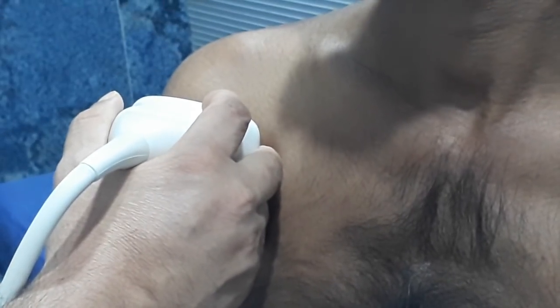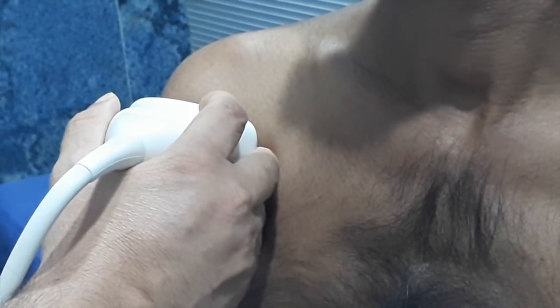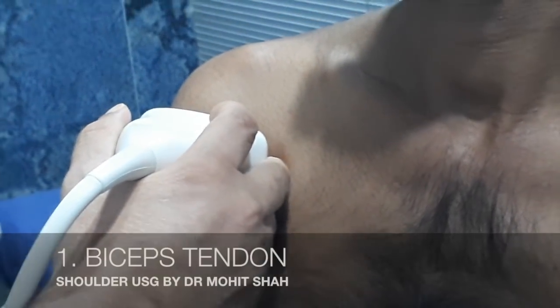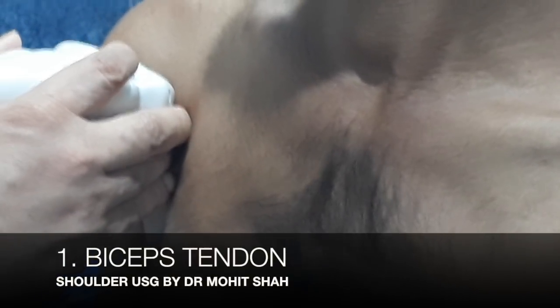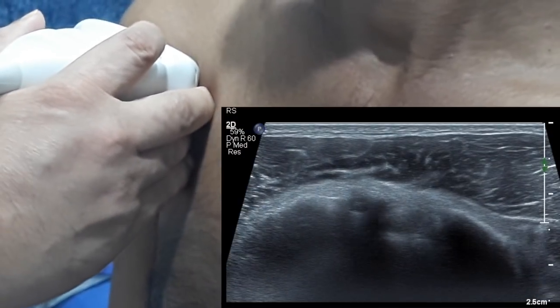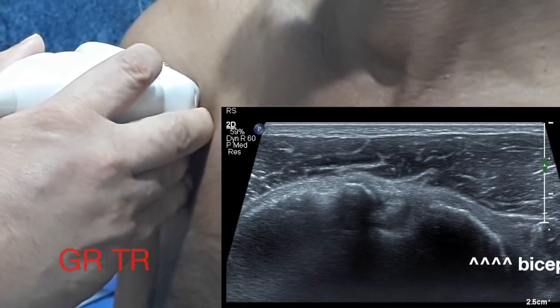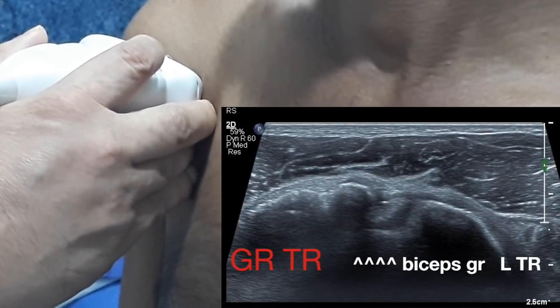We begin from the anterior aspect by keeping our probe in a transverse fashion over the bicipital groove. As you can see in this video, you have the lesser tuberosity and the greater tuberosity, and in between you have the bicipital groove with the biceps tendon within it.